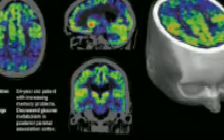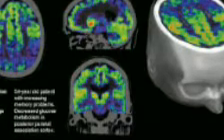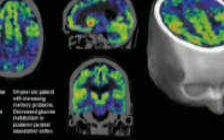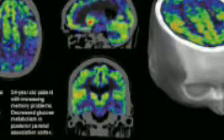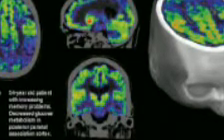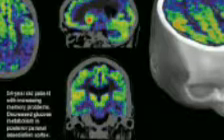Risks. For your PET scan, a radioactive drug, tracer, will be put into your body. Because the amount of radiation you're exposed to is small, the risk of negative effects from it is low. But the tracer might cause a major allergic reaction, in rare instances. Expose your unborn baby to radiation if you are pregnant. Expose your child to radiation if you are breastfeeding. Talk with your doctor about the benefits and risks of a PET scan.